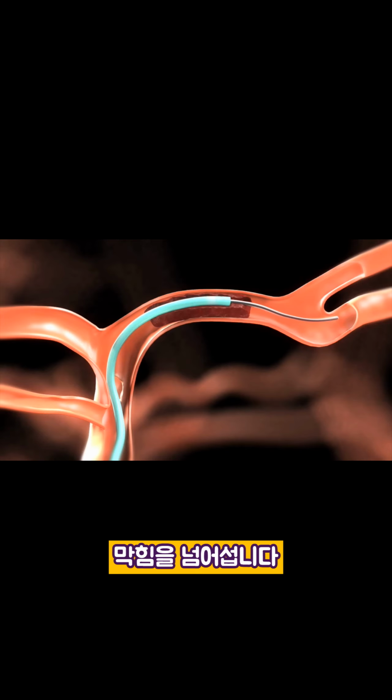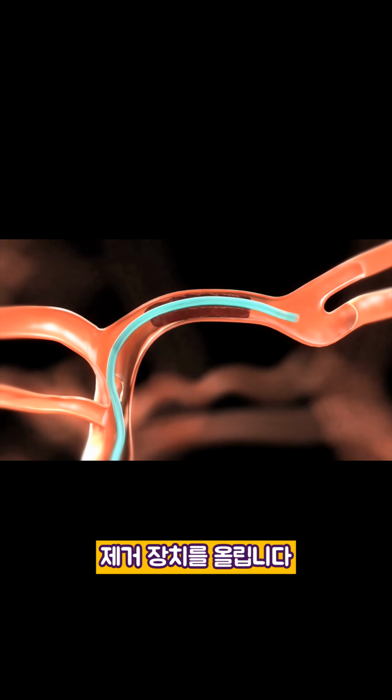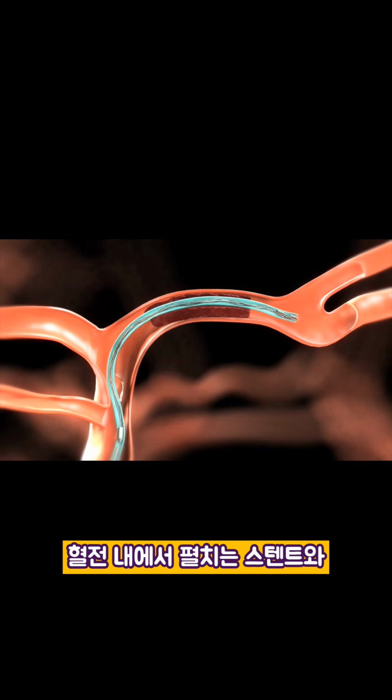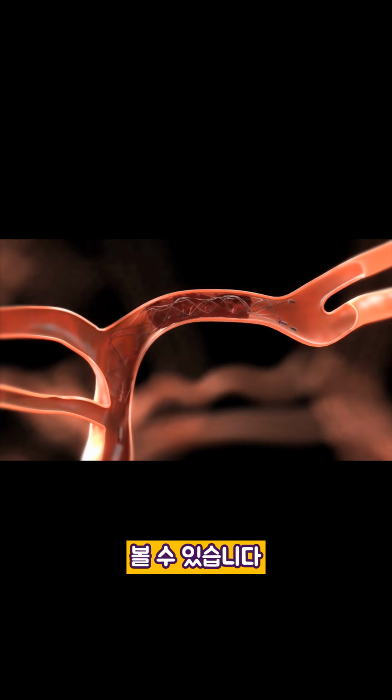the blockage. Once we're across the blockage, we bring up a mechanical thrombectomy device, which is kind of a stent on a stick configuration. It's a stent-like device that we unsheath within the clot in the blockage. You can see the stent is opening up and actually restoring blood flow immediately.